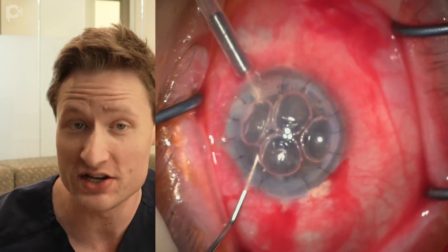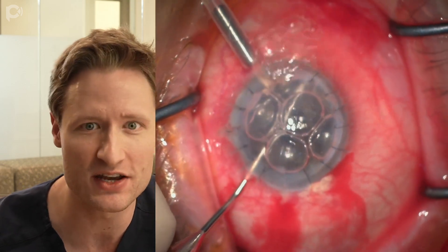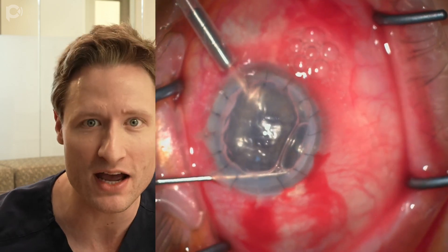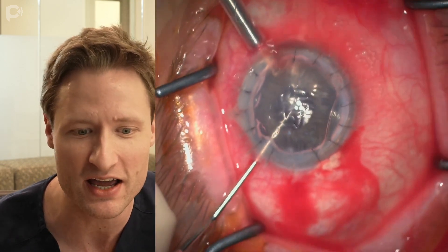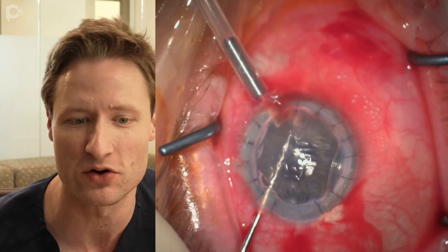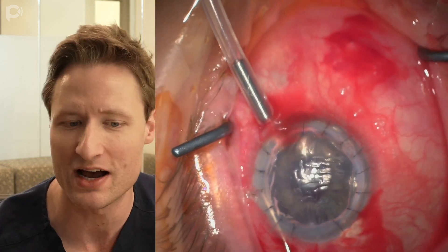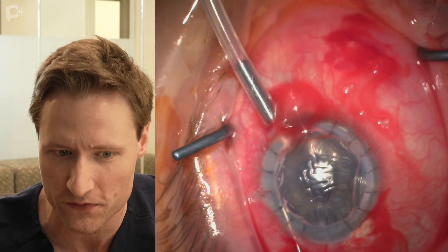The knives that I like to use for these cases are super sharp. The best ones are made by Manny, but we also use knives made by BVI — they're much sharper than the typical Alcon blade. Those are a pleasure to work with and make the operation much more enjoyable.